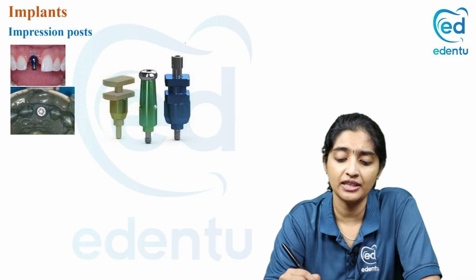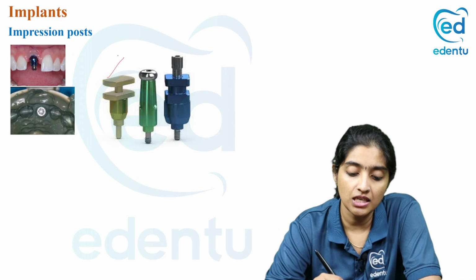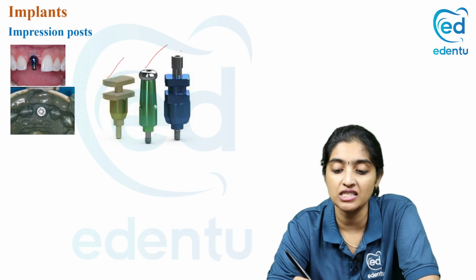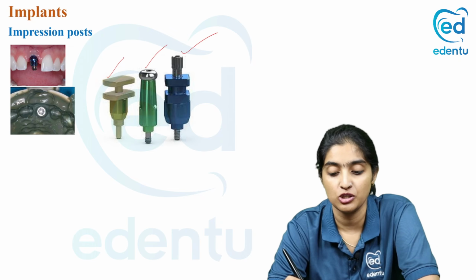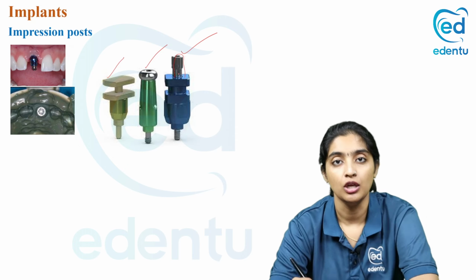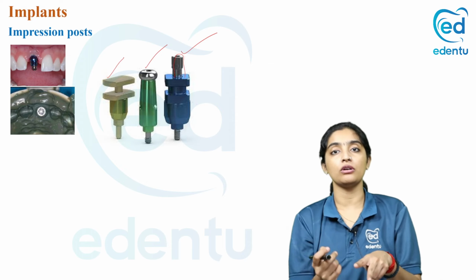These are the three different types of posts. This is called a snap-on post or a closed fit post, and this is a closed tray impression post, and this is an open tray impression post. You can see the difference. This will be longer and the screw is longer. So this will come out of your tray.